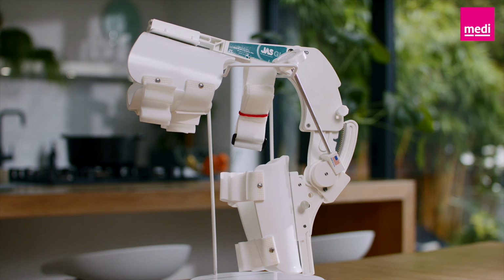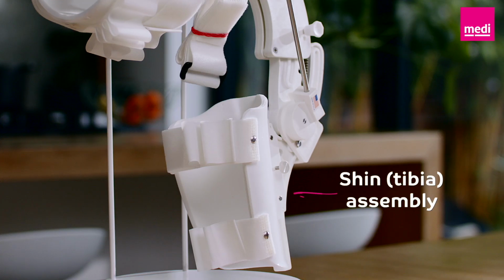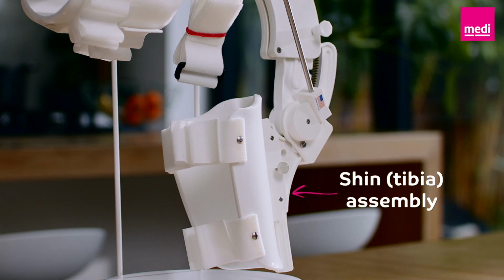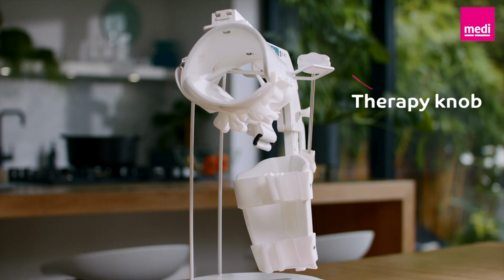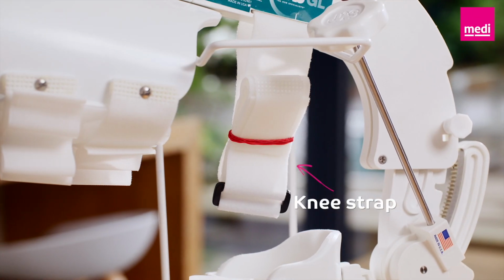Your custom-fit JAS brace comes with the following parts: thigh assembly, the shin, also known as tibia, assembly, pull pin, therapy knob, cuff straps, and lastly, the knee strap.